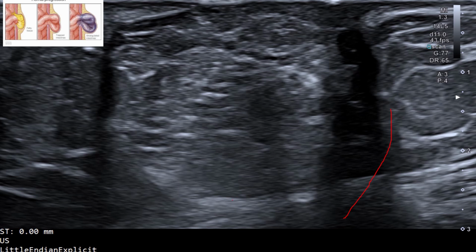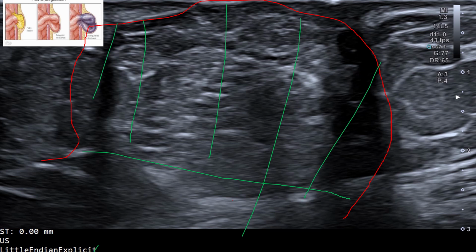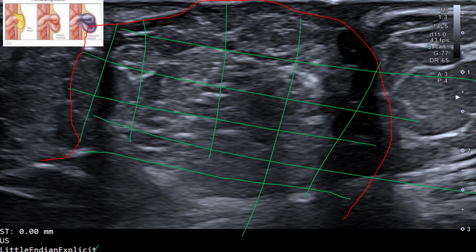You can see it nicely. There it is. So that's the hernia. The area that you are supposed to measure to make sure that it's reducing is this area there. That's the neck. Then this area must go in, all of that area. If this is not happening, it means that it's not reducing. And also, if it starts not to compress, it can be an indicator that strangulation is happening.